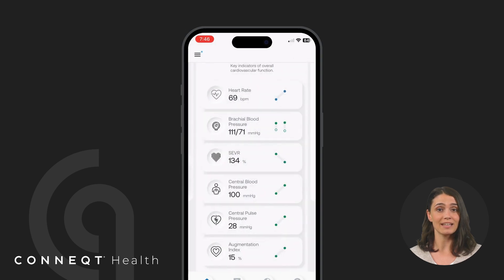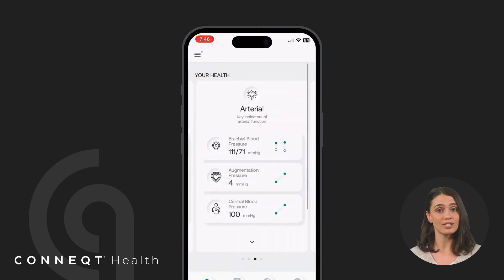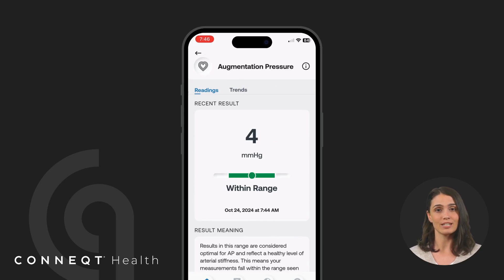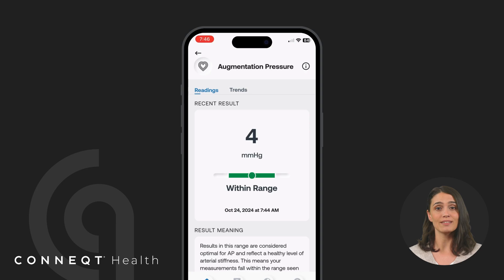Augmentation pressure, AP, shows the extra pressure the heart exerts to overcome arterial stiffness, revealing how hard the heart is working. In simple terms, using a plumbing example, AP is the additional push your heart needs to pump blood because of stiff arteries, like how a pump has to work harder to move water through narrow pipes.